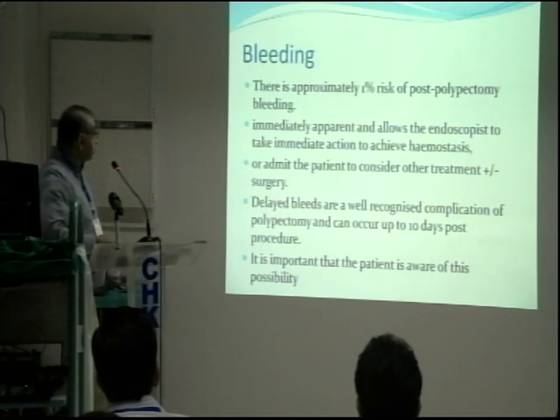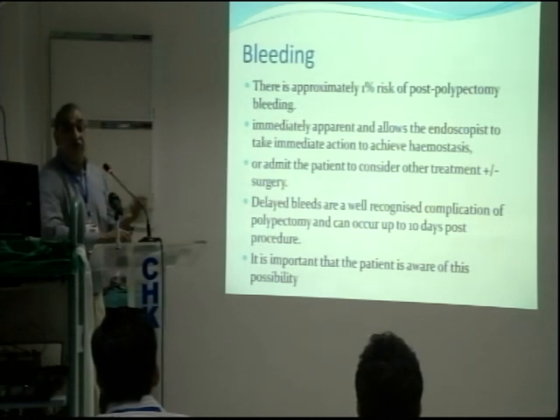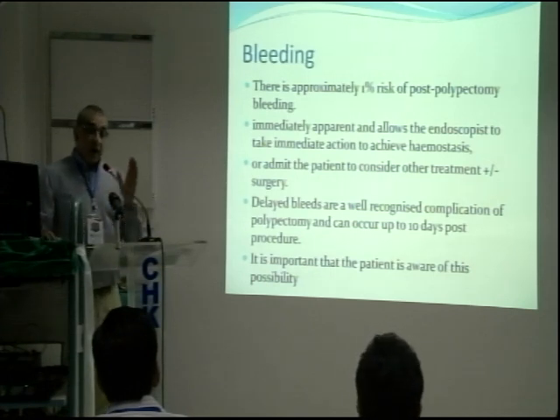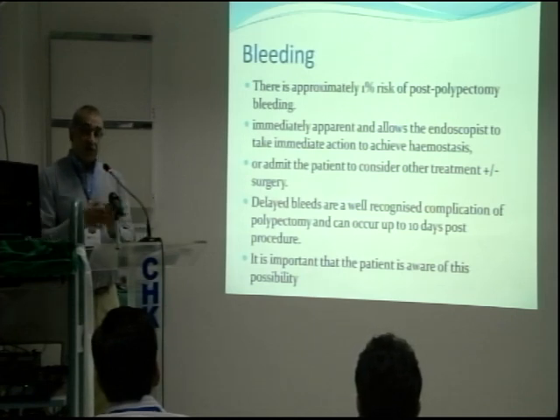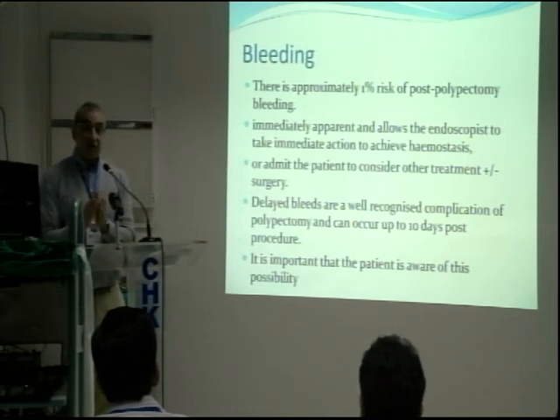And the important thing is, as I said, anything that happens in front of your eyes is good because you can treat it immediately. Especially if you carry out a polypectomy on a polyp with a big stalk, as soon as you remove the polyp, keep your snare sticking out of your scope, because in a few seconds after the polypectomy, if the polyp stalk is going to bleed, you can put the snare around it and just apply tamponade.